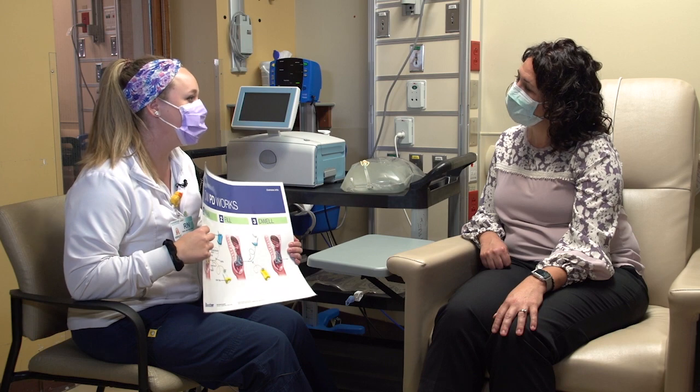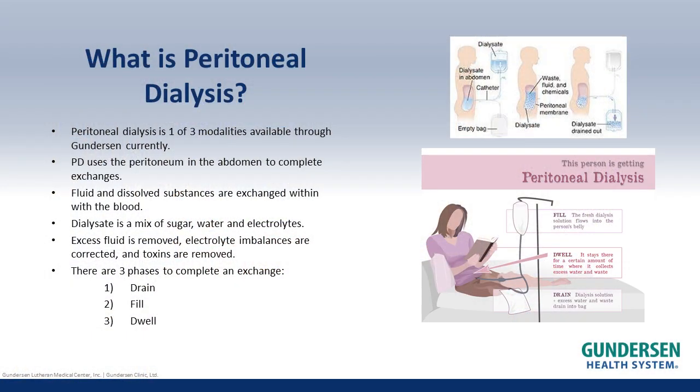Sure. So peritoneal dialysis is one of 3 modalities that is offered here at Gundersen. It uses your peritoneal cavity to dialyze. It does exchanges within the peritoneal cavity. Fluid and dissolved substances are exchanged within the blood. Dialysate is a mix of sugar, water, and the electrolytes. Excess fluid is removed, electrolyte imbalances are corrected, and toxins are removed.